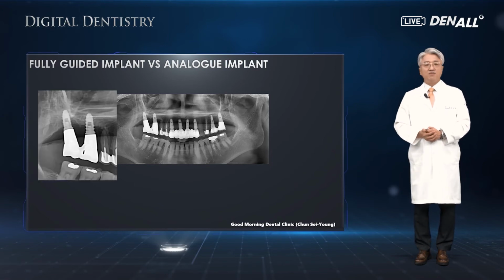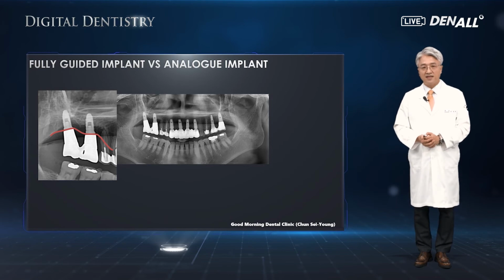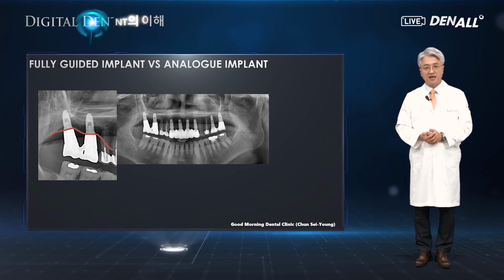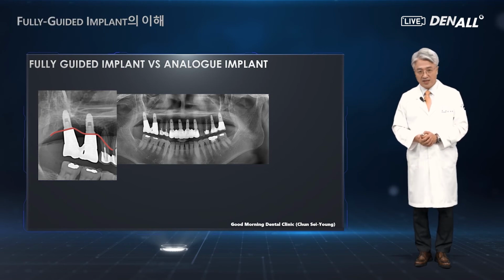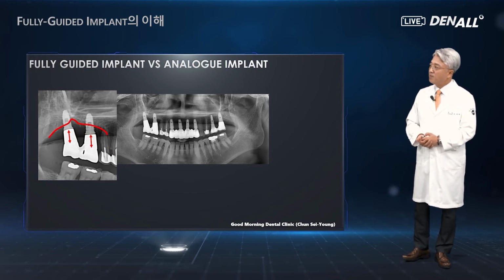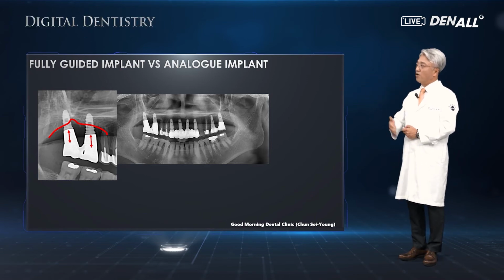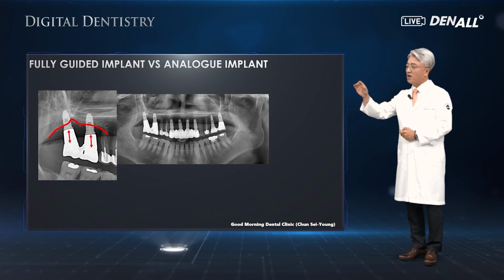In the past, the implants were placed in another dental office, and the patient came to my office. I believe that the original bone height was like this. The patient said they were placed a long time ago. The abutment is designed like this, very long. Currently, the bone is resorbed to this level. In my opinion, the abutment is quite long.